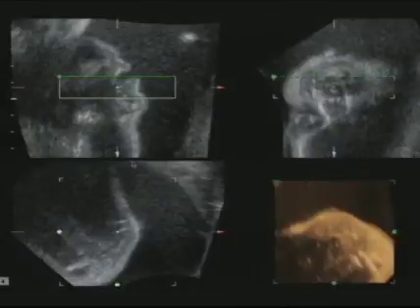Here again, the fetus has been imaged in profile and then flipped upside down with the chin here and the forehead there. I've put in my render box with my point of view green box right in the mouth. And we're looking up at the palate. And what do we have here? We have a rent or a space right in the middle of the palate, a linear space.